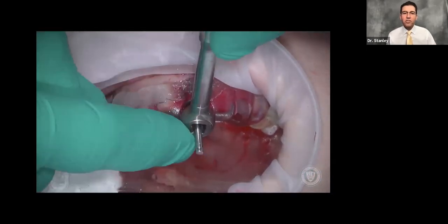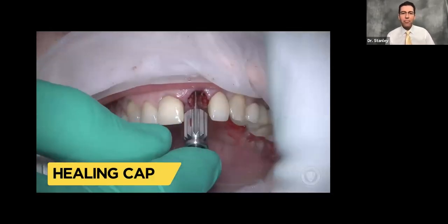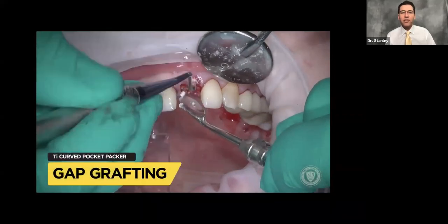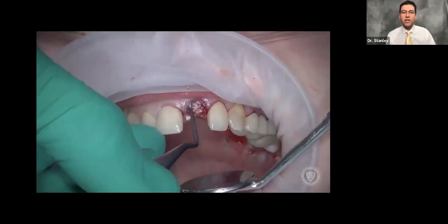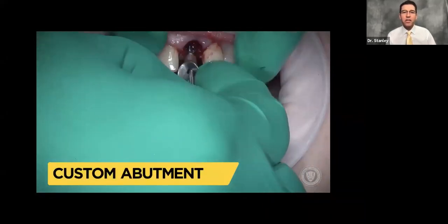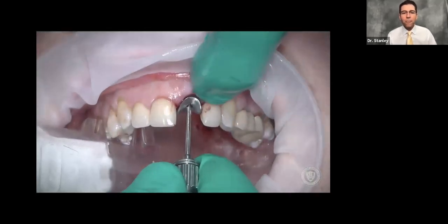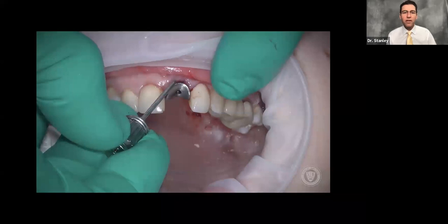Now that we're down, we want to make sure our timing is right. We put our wrench on there and look at the driver to make sure it has a flat spot to the buccal. We remove the guide and place the healing cap into the implant very lightly — we don't want to wiggle this implant loose at this point because it doesn't have a lot of stability. Then we gap graft — grafting the gap around the implant to help ensure that tissue doesn't collapse during healing.